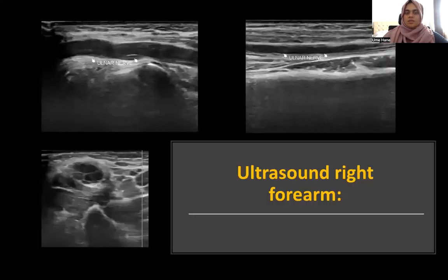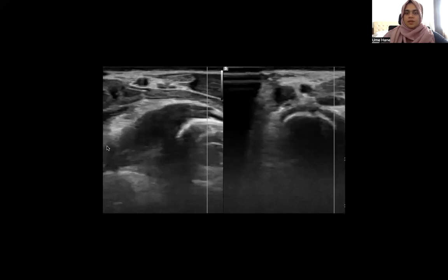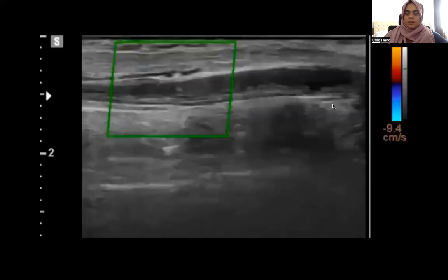The patient was referred for ultrasound of the forearm, which showed diffuse enlargement of the ulnar nerve along with hypoechogenicity. There were few lymph nodes seen in the region of the medial epicondyle measuring 5 to 7 mm. On color Doppler, there was no significant increase in vascularity or peripheral vascularity.